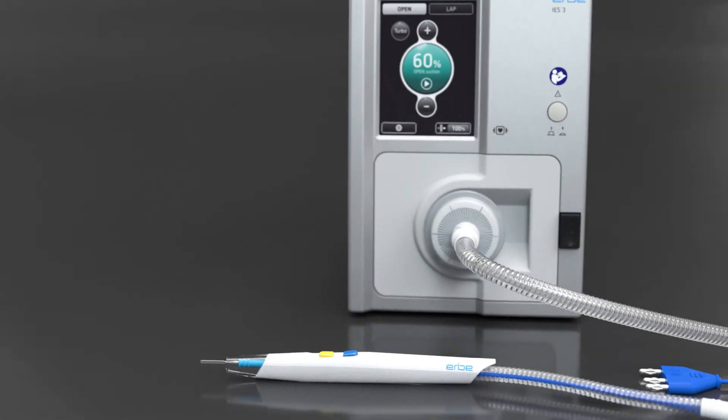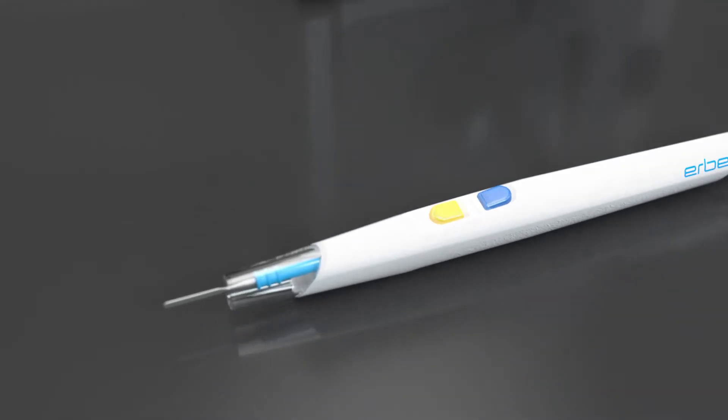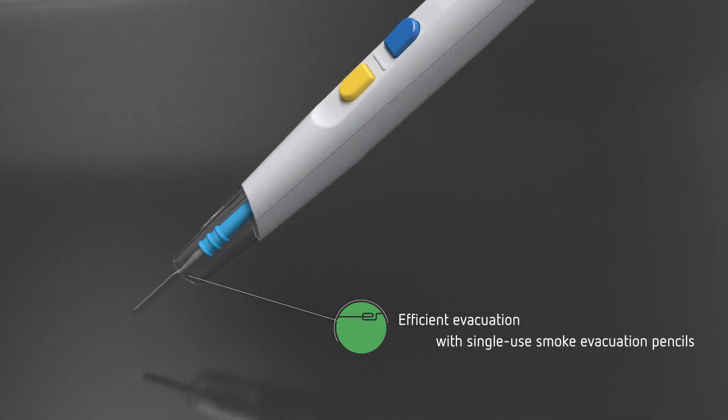In combination with smoke evacuation pencils, you can cut and coagulate while simultaneously evacuating the resulting smoke. Direct capture using a smoke evacuation pencil placed just a few millimeters above the source is extremely efficient.